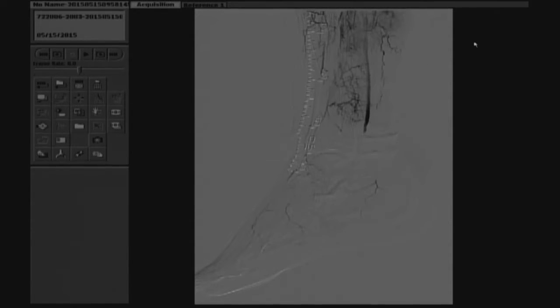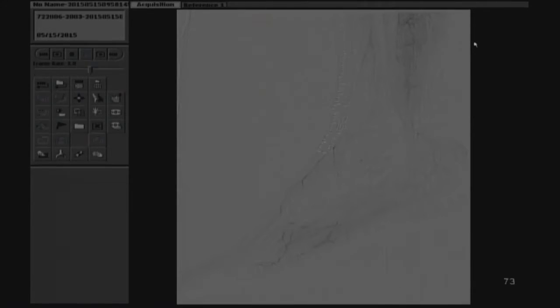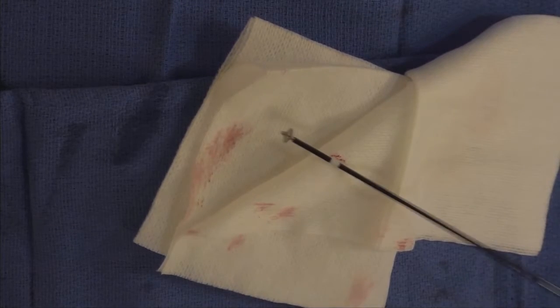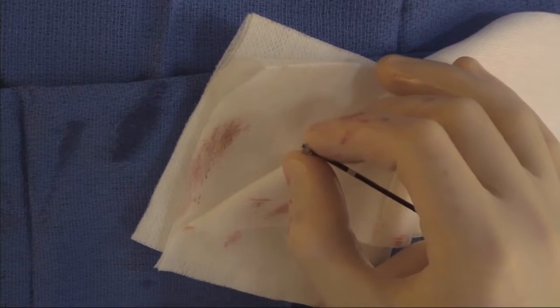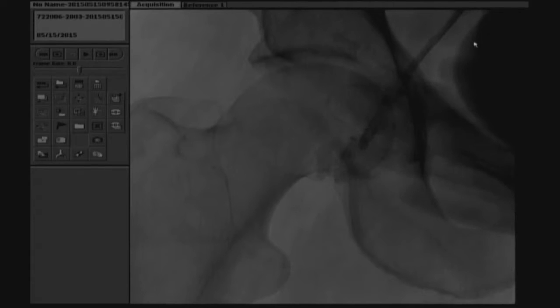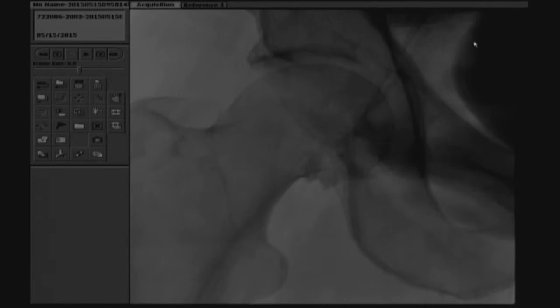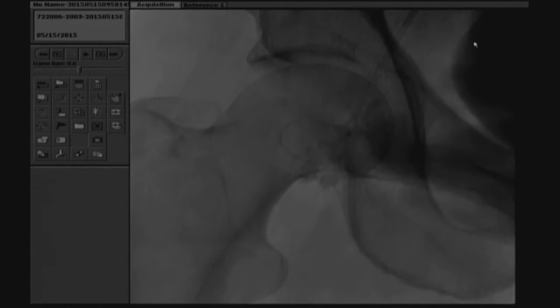This is the advantage of accessing these vessels within the distal third of the lower extremity — it's a compressible site and there is no concern for compartment syndrome at this level. This angiographic picture shows blood flow within the posterior tibial artery with the BOA device applied, and you can see TIMI 1 flow beyond the access point. Once the BOA device is released within a few minutes, even with normal ACT levels, you can see adequate normal flow. We will then proceed with closure of the antegrade access site using a Vascade closure device, which uses an external plug to perform hemostasis.